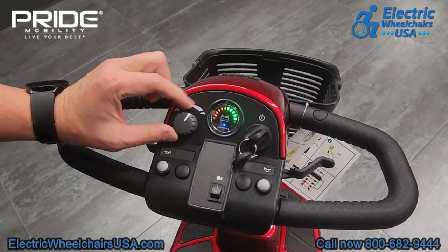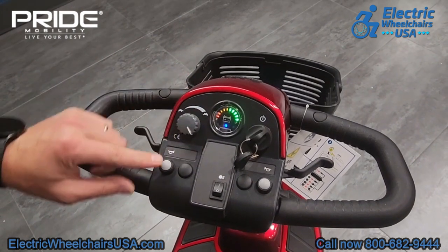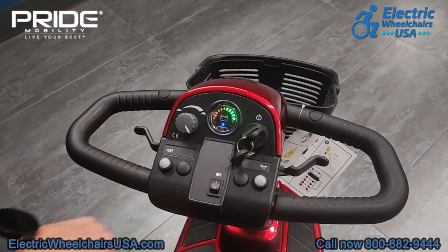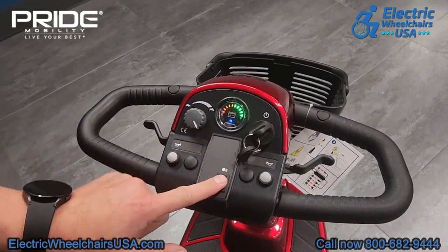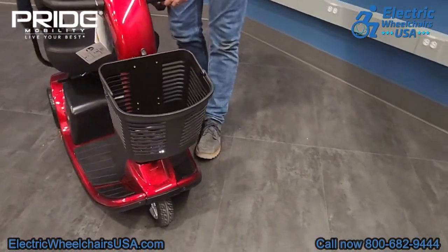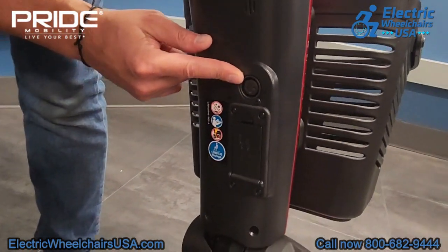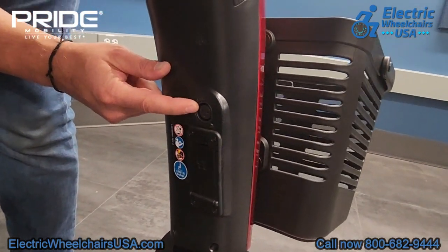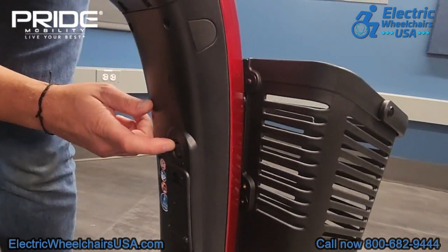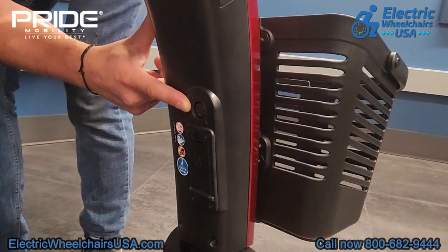Something to keep in mind: if you're riding around crowds of people, you might want to turn the speed all the way down. These two white buttons are your horn, and the button in the middle is your lighting package — there is an LED front headlight that turns on once you press this button. This is where the charging port is located. It's positioned up high, so you don't have to worry about bending down to charge the scooter. You can easily access it while sitting in the seat.